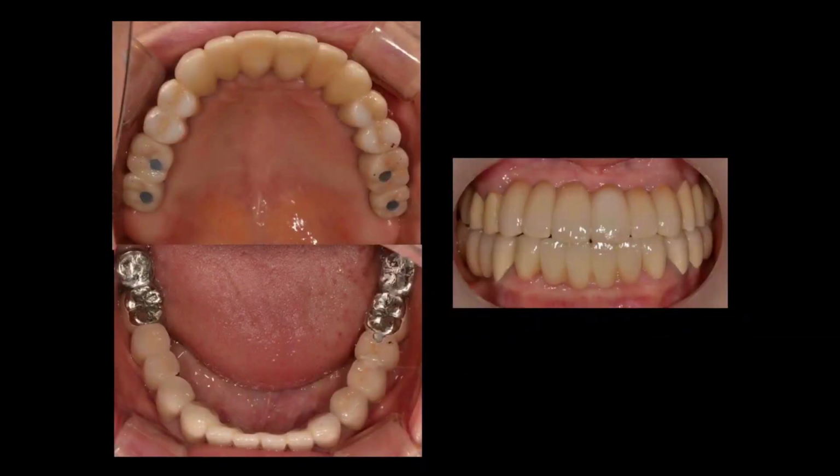Then, on the day when the crown is to be removed, we go ahead and treat the ones that need endo all in one day. Then we use these materials to make the provisionals. This way, the patient is able to chew and eat throughout the entire treatment period. The downside is that the temporary crowns can break easily, and this is why we make these duplicates.